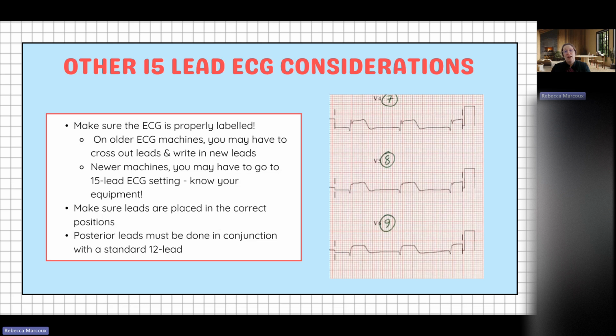And it's important to not have a big gap. If you did a 12 lead and your physician looks at it 10 minutes later and says, do a 15 lead, please redo your 12 lead and then also add your extra 3 leads. Things can change a lot in 10 minutes. So we want to make sure that when we are doing the 15 leads, we're doing them all in conjunction at the same time, or as close together as we can.